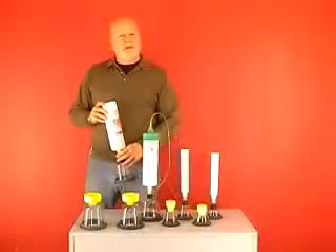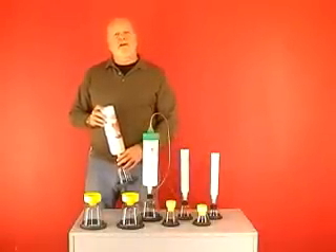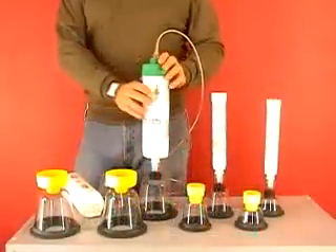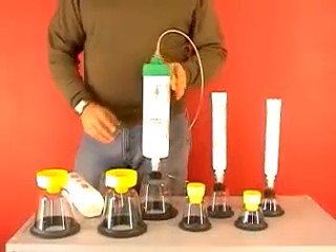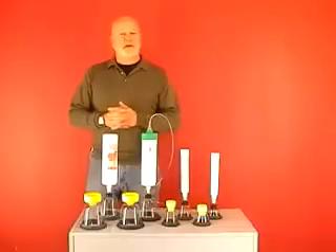There are McCulloch resuscitators for calves, foals, lambs, kids, crias and piglets. For veterinarian use, all of the McCulloch resuscitators are compatible with ET tubes. Also available is an oxygen adapter, standard with the foal resuscitation kit, which enables units to deliver up to 100% oxygen concentration. This comes with two meters of oxygen tubing to connect to your oxygen tank.